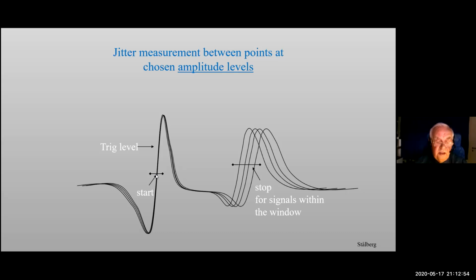We started a clock in the computer when the signal starts here, and when it passes through this window, this clock was stopped. So here it was stopped, and then next discharge maybe here, next time maybe here, next time here. So this was the variability. We get time intervals that we can calculate and express variability.